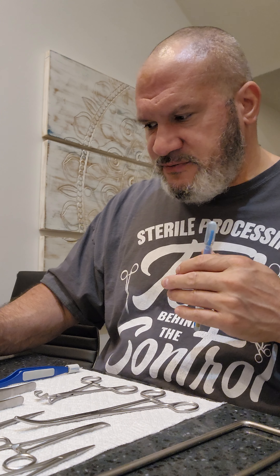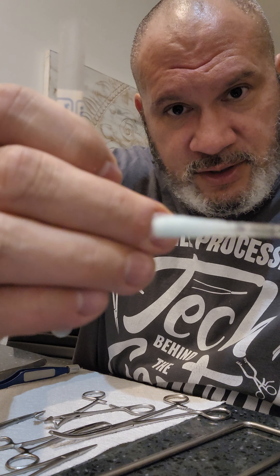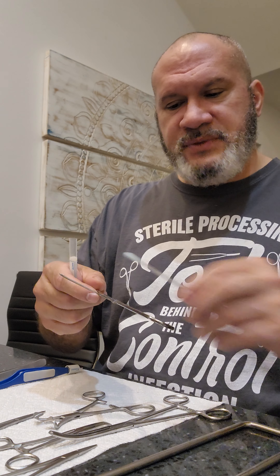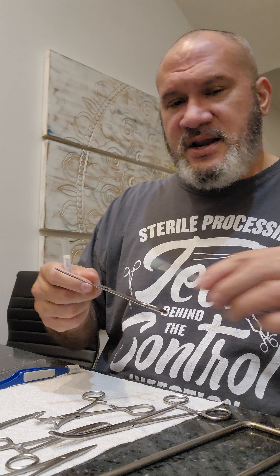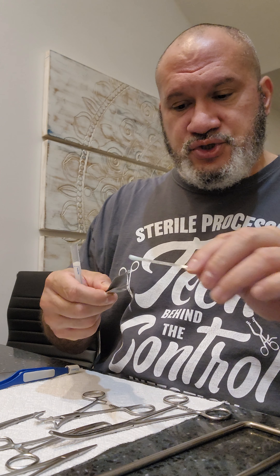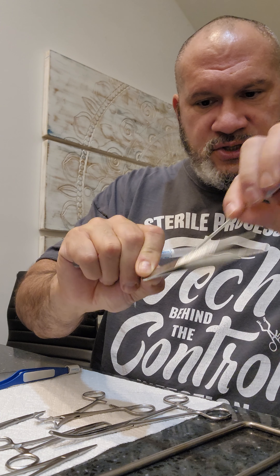Here I have two types of scissors, three types of forceps, and about five different clamps. When you do cleaning verification, you want to grab your soil tester — this one already has a little residual blue on it, so there was some protein somewhere. Wear gloves when you do your soil testing and cleaning verification. You want to swab your instruments on the most used portion of the instrument, grabbing one or two of each depending on the size of the tray, representative of each instrument type. For forceps, do the jaws because that's the most used — where the doctor touches — and get down in that crevice because those are hard to reach areas to clean.